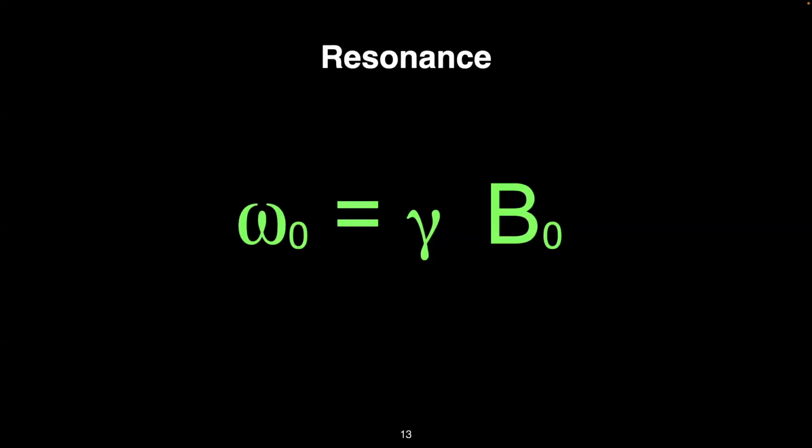So now we have our protons, the little magnets, spinning around this main field. And the frequency at which they do this is determined by B0, which is the strength of the main field, and this other variable called gamma, which is fixed per nuclei or per species that you're imaging. So this tells you, per unit of magnetic field, how much frequency you can get out of that.